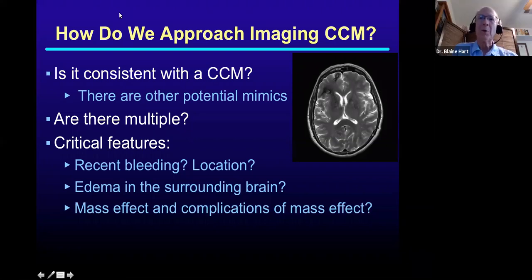Bright areas in most other causes of hemorrhage, we would say, oh, the bright area goes away within about 2 to 4 weeks, something like that. And yet it's clear that with cavernous malformations, those bright areas can last for months and months. So they are more complicated. Yeah.